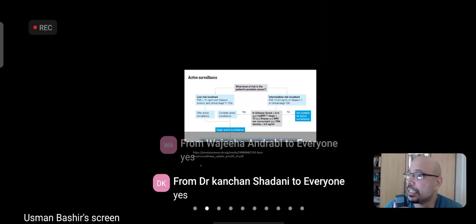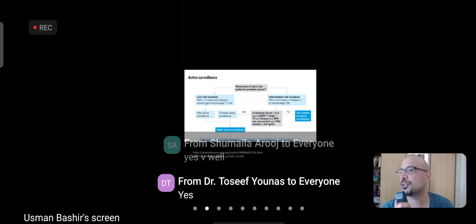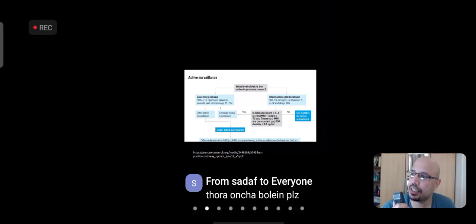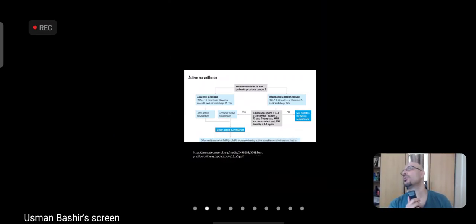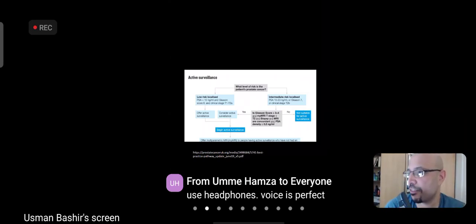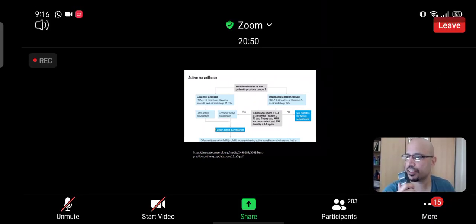Right. So low risk localized. So this is basically going to tell you how we work. It's a multidisciplinary thing. Staging जो है prostate cancer की, ये prostate MRI कर रहा है, PSA जो है ये blood test कर रहा है, Gleason score biopsy के pathologist कर रहा है, और ये सारी चीजें देख रहा है urologist. Right? So the urologist gets back the prostate MRI report, the lab report, and the pathology results, and he risk stratifies them. And if they think, okay, this guy is at fairly low risk of disease progression, then they will consider active surveillance, and they do annual multiparametric MRI.